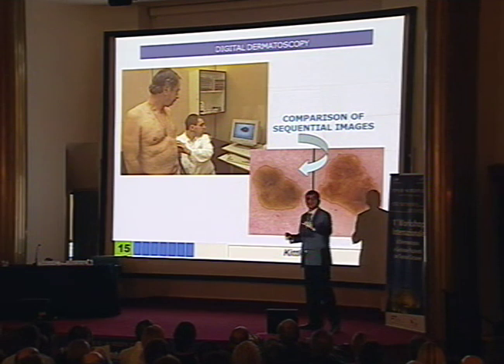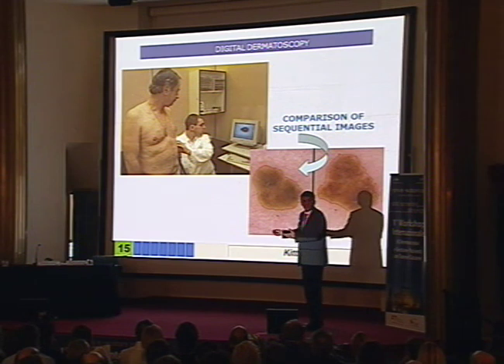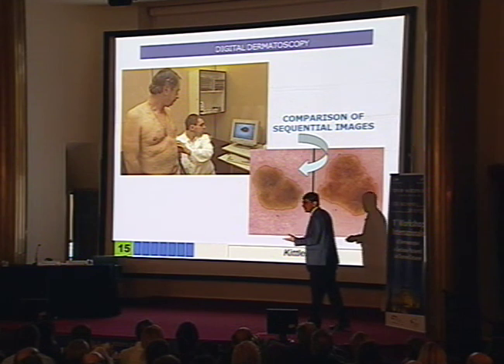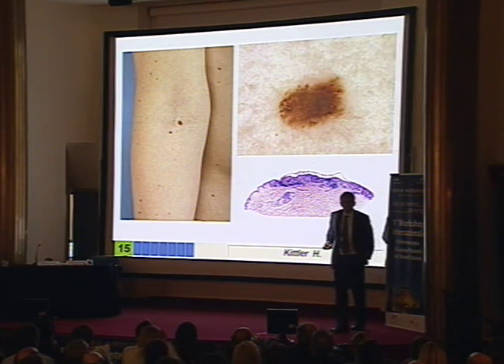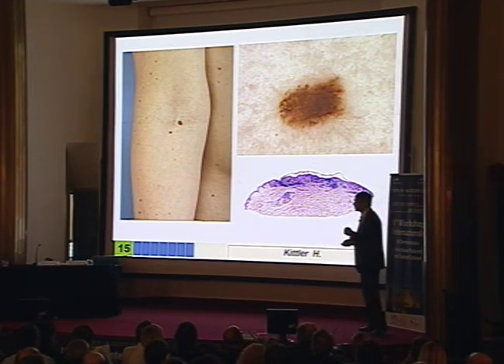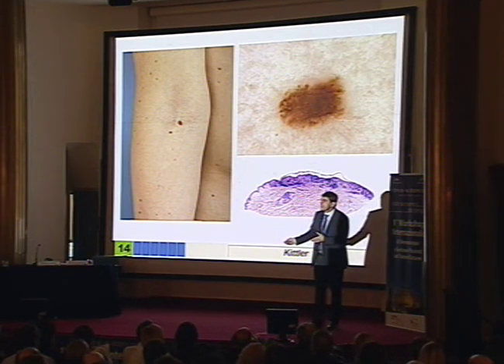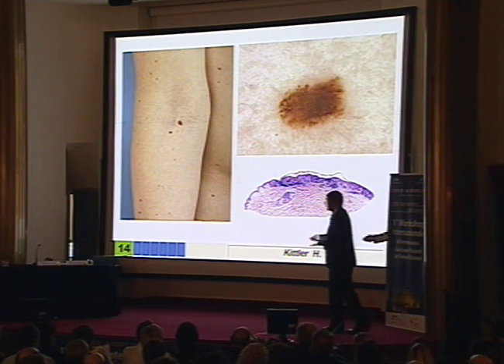The image quality usually is worse than with the dermoscope. So the only major advantage of the systems is that you can easily store it, retrieve it, and put it in a computer system. That's the main advantage. And the problem is we should not use the follow-up if we are insecure because we don't know dermatoscopy. This lesion, although it's small, there is no indication for monitoring, because the diagnosis of a melanoma can be made easily at the first visit. You should not monitor it. There's no need to do that.